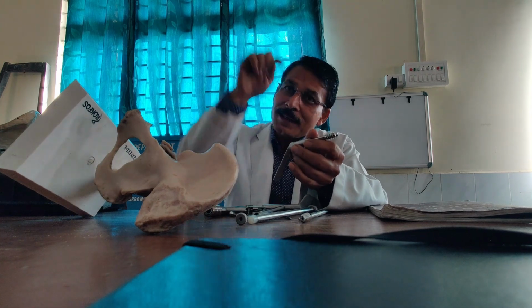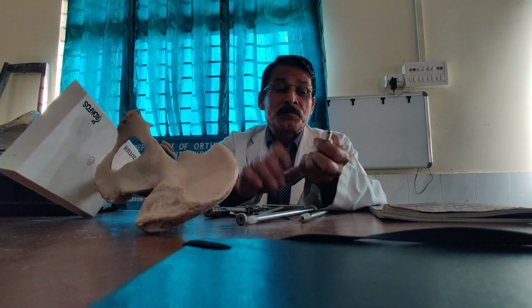Particularly, you have to give an additional plate to support the trochanter, the comminuted trochanter. So integrity of the lateral wall is important. If not, then you can take the help of an additional plate to support the lateral wall. But medial wall continuity is very important. Otherwise, it is going to fail. In certain situations, if you are not happy with the medial wall, you can go for grafting and other things to maintain the integrity of the medial wall. Understood? These are important things to understand.